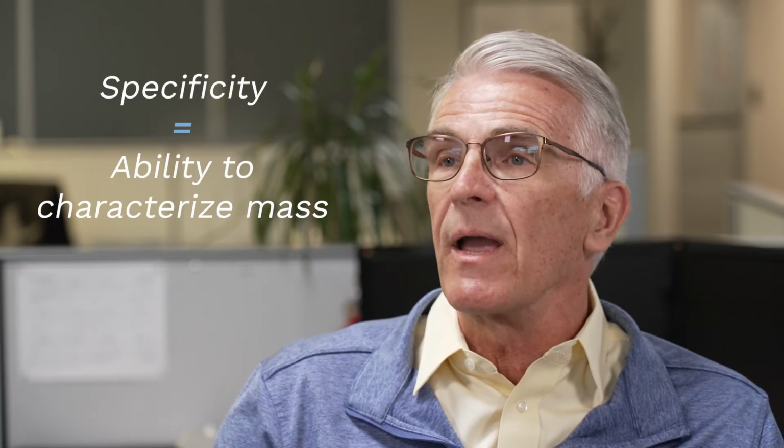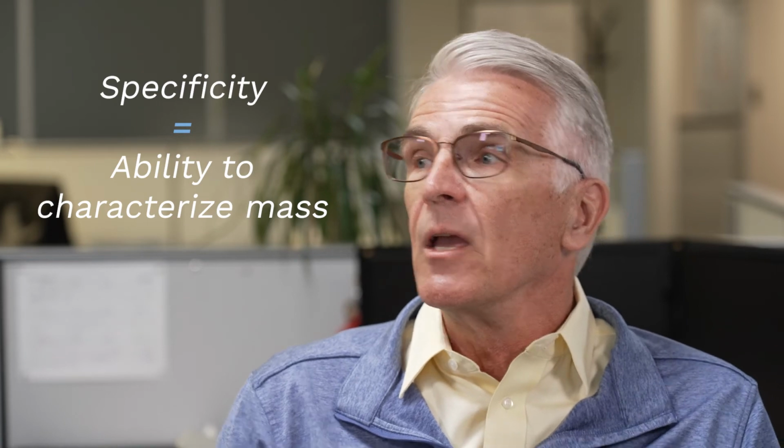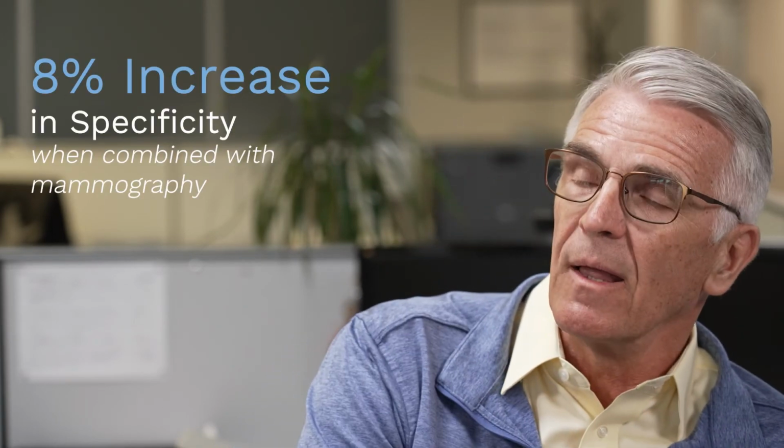All these additional parameters of analyzing tissue came into play and say, no, that one is pretty much benign, don't worry about it. Whereas that one over there, I still am not quite sure of, so yes, that is worth a callback. But not only worth a callback where they usually characterize it, we've already characterized it in that process. So we're able to not biopsy the things that don't need to be biopsied. That was an 8% improvement in specificity, as well as finding more cancers. So now that's the holy grail of being able to do screening, because you get more bang for the buck. More cancers for less inconvenience to the patient, and more savings for our healthcare.